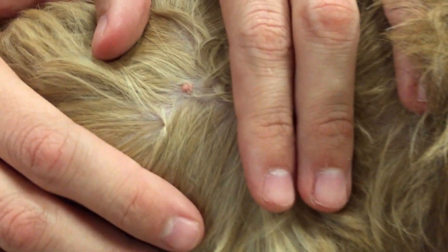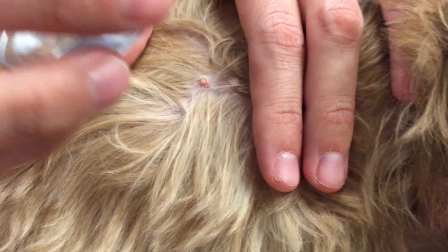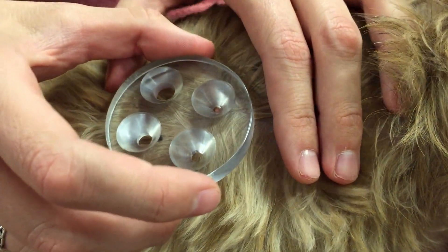Once we find the mass and locate what we want to remove, we take our handy size measuring plate and make sure we find a size that fits over the mass.